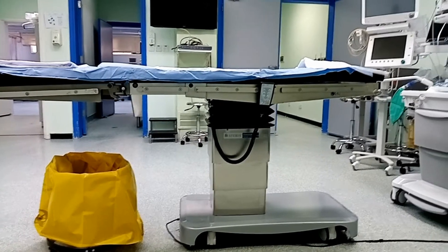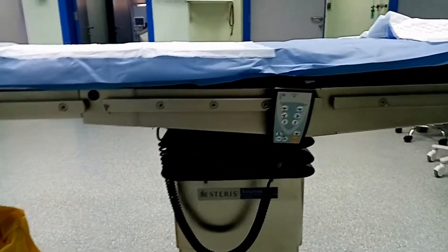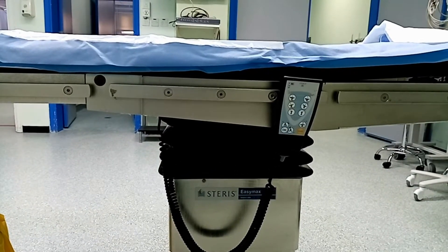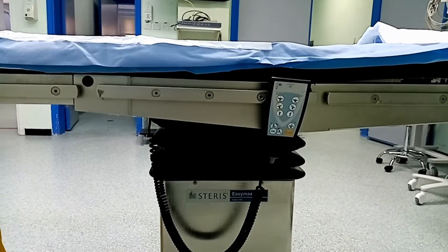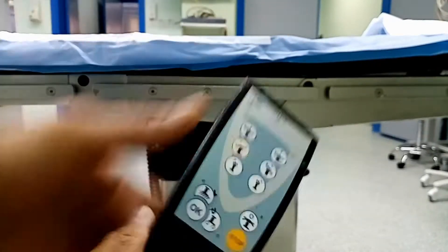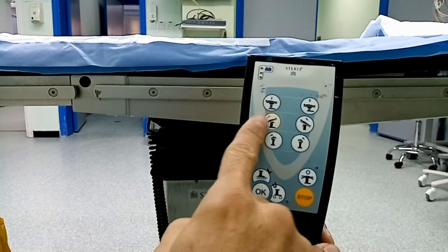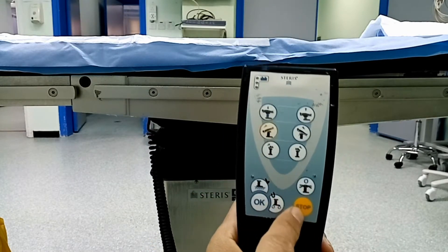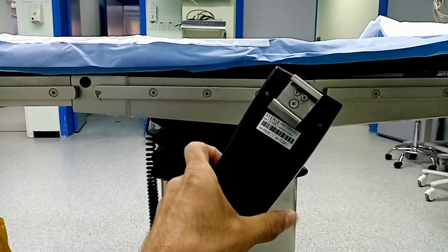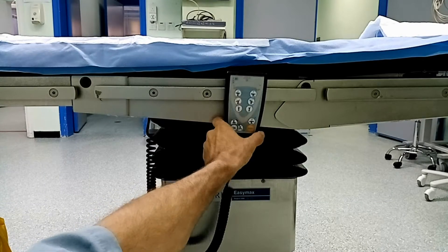أول جهاز هنتكلم عنه هو طاولة العمليات. الطاولة بتوفر مجموعة من الحركات والوضعيات اللي بيطلبها الجراح أو الطاقم الطبي. الطاولات حالياً كلها كهربائية، بيتم التحكم عن طريق الريموت. الطاولة ببساطة عبارة عن جزئين: القاعدة اللي تحت فيها الجزء الإلكتروني مع الصمامات اللي بتولد الحركات، وفيها خزان زيت ومضخات للزيت. الزيت بيتحرك عن طريق الصمامات حسب توجيه الريموت.